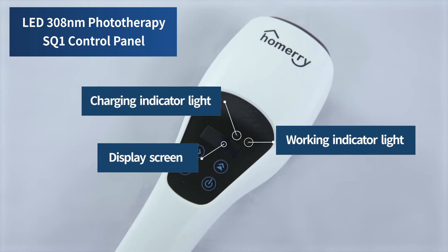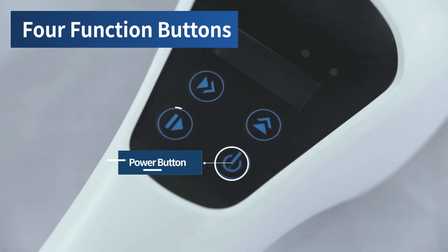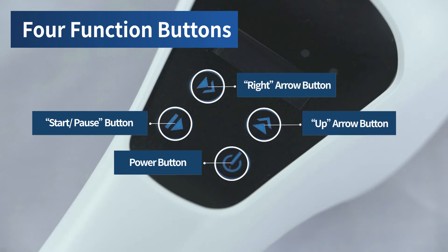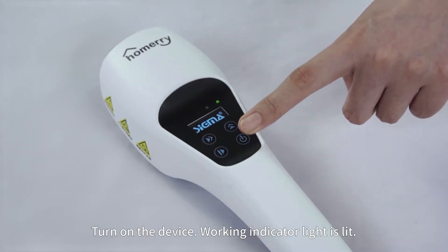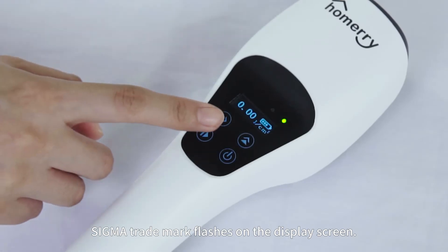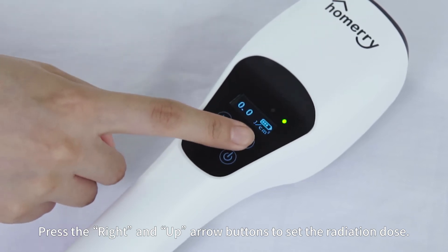The device includes a Display Screen and four function buttons: Power Button, Start/Pause Button, Right Arrow Button, and Up Arrow Button. The Right and Up Arrow Buttons are used to set the radiation dose. Turn on the device and the Working Indicator Light is lit; the Sigma trademark flashes on the display screen. Press the Right and Up Arrow buttons to set the radiation dose.